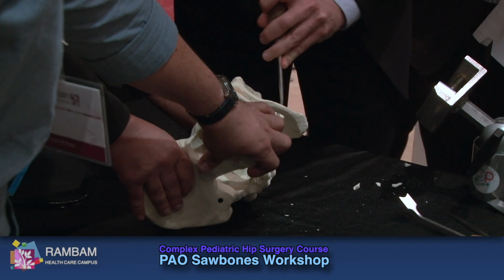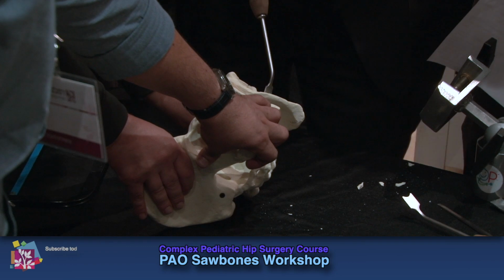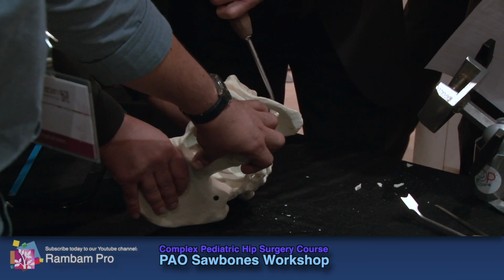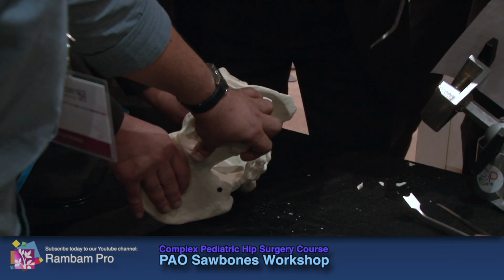What you're doing, about the width of this blade, if you go in too far, you catch your shoulder there, and it can be quite difficult to get it out. So whenever I'm going in there, I'll wiggle around. Right, this maneuver, your hand.